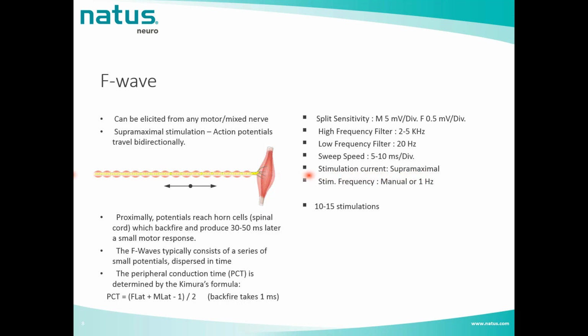The stimulation intensity should be supramaximal to get a supramaximal motor response, and therefore the proper F wave. And we will do 10 to 15 stimulations at quite a low frequency. We can do it manually or at a low rate, around 1 Hz.